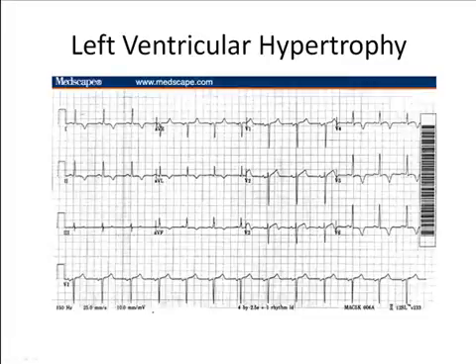Here we see an ST elevation in the septal and anterior leads, but closer evaluation reveals an ST mimicker, left ventricular hypertrophy. V2's S wave shows 20 millimeters of amplitude, while V6's R wave shows 16 millimeters of amplitude. This patient would warrant every treatment modality as a STEMI except no cath lab activation. So in short, this is a potential cardiac event, just not a STEMI.